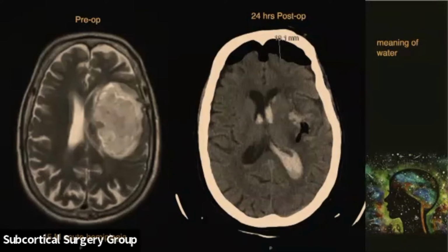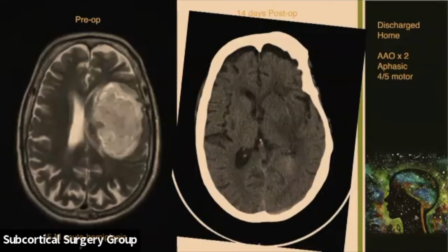This was a sort of hyperacute evacuation, and you see postoperatively that a lot of the brain that appears to have almost disappeared is in fact intact and is recoverable. So this is at 2 weeks. A lot of the anatomy, the deep white matter structures just outside the left thalamus, the putamen, the external capsule have reformed. He is very aphasic, weak, but actually went home.